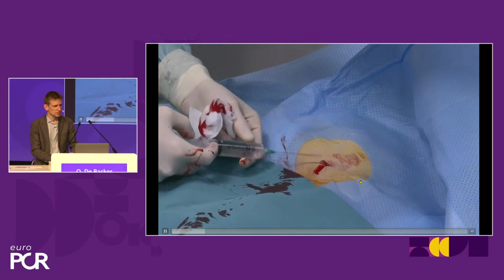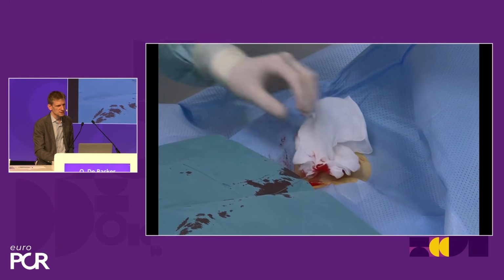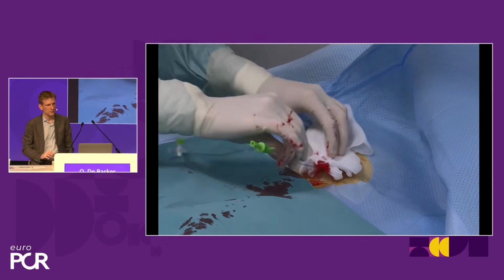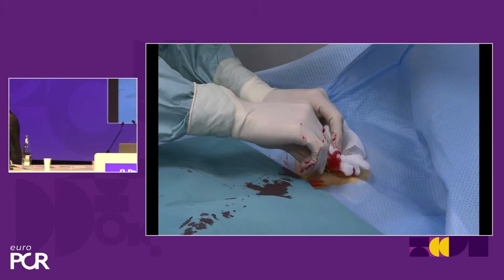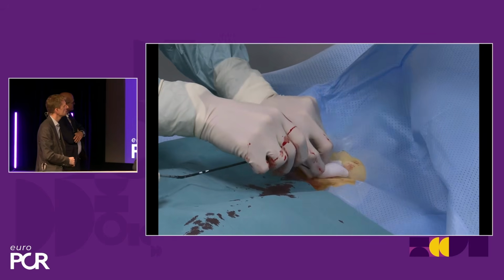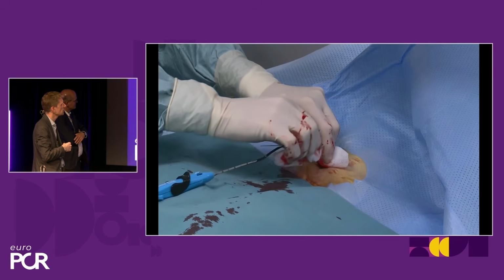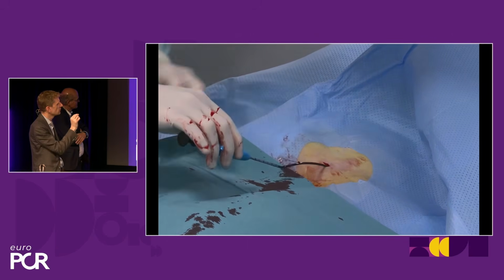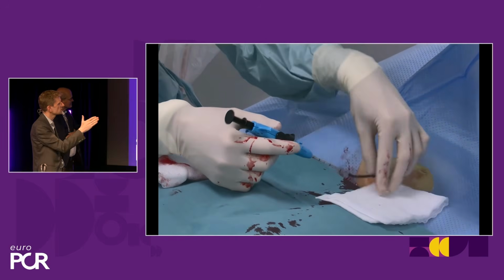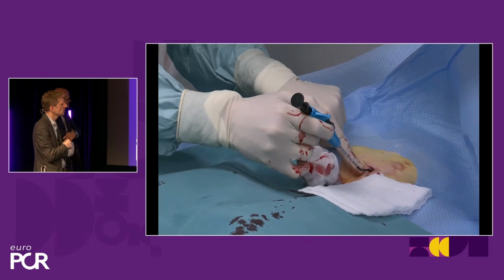Okay, good. So we give a little bit of additional local anesthesia. Now the 6 French sheath goes in first to open up the trajectory here. Then the Pro-style comes in. You see again, we pull back on the wire if it's a short wire until it comes out of the side port. We hold it, we go in, until the hub just disappears under the skin level. So we go in here in the axis of the vessel again. Here we go. Here we're just in.